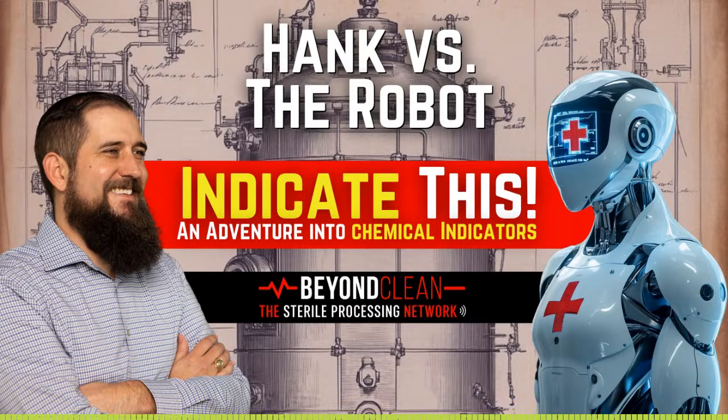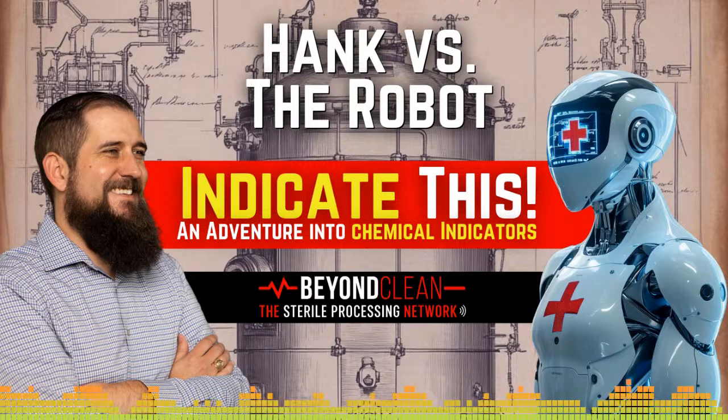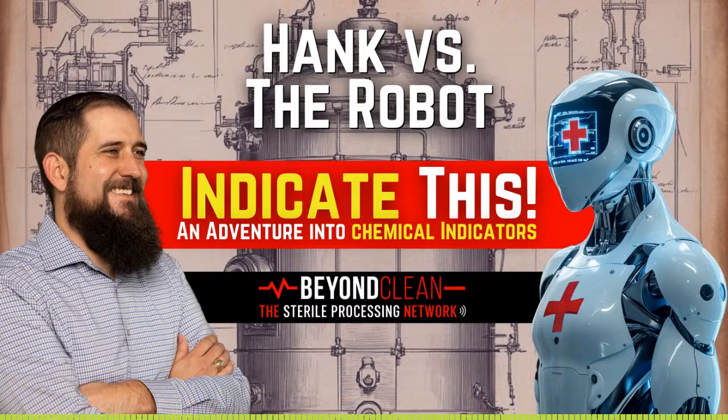Two, low cost. Using chemical dyes for a visible change is cost-effective for manufacturers and end users. It also doesn't require specialized equipment to interpret the results. Three, historical precedent. Color-based indicators have been around for decades, and the industry is comfortable with them. They've stood the test of time because, when used correctly, they're reliable.